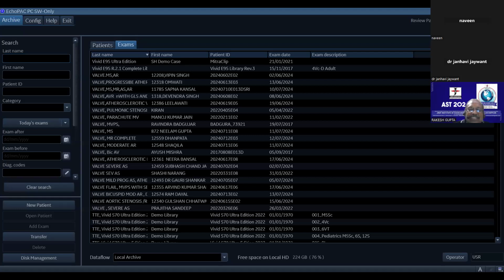So now you can see this slide, what she was asking me, correct? Wanted to know how to trace it, correct? In AR, this is holodiastolic reversal of flow in the descending aorta.